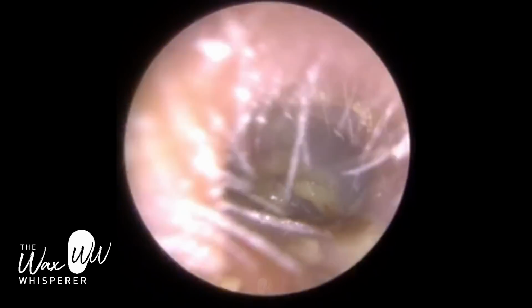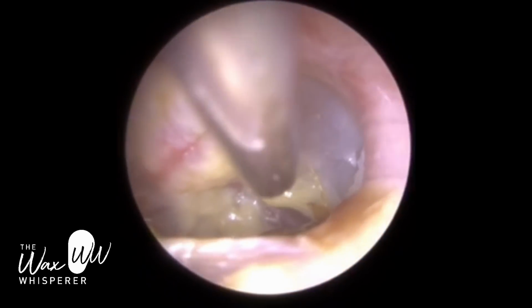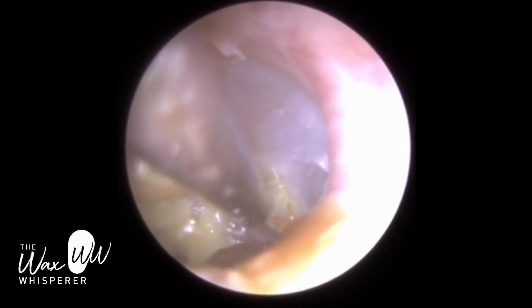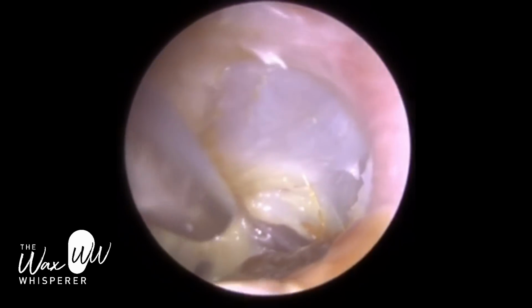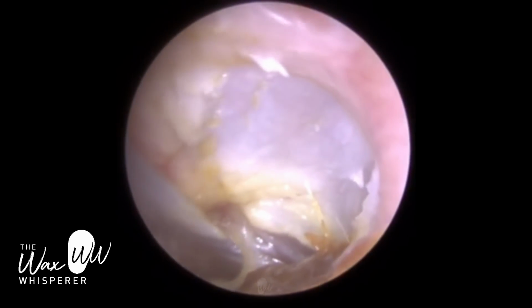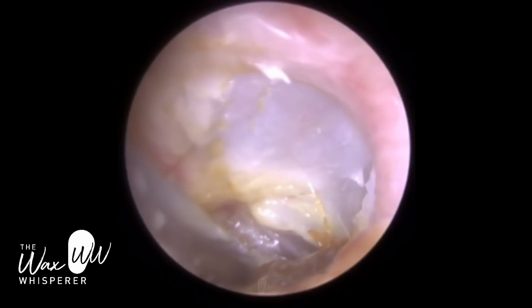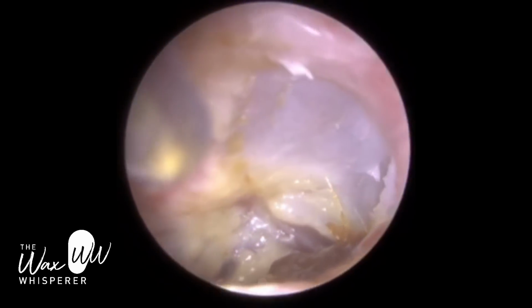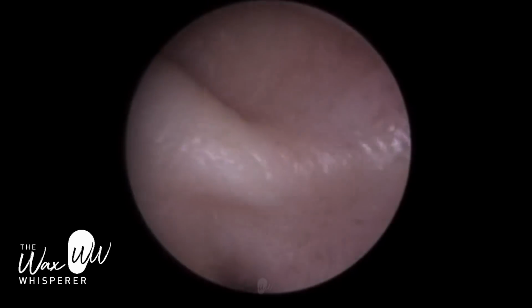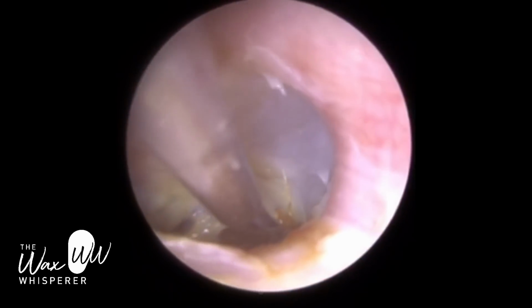But you can see what's happened. The patient hadn't drained their ear, the wax has got soft and runny and it's trickled down towards the eardrum. It's rested on the eardrum, and also in the inferior recess. Just where I am now, about half a centimetre away from the eardrum, the canal narrows and then widens again and creates recesses all the way around. The most prominent recess is the inferior, at the bottom, almost like a trench, and there's one anterior, to the left-hand side of the eardrum in this case. So it's like a little ridge and the wax can settle.